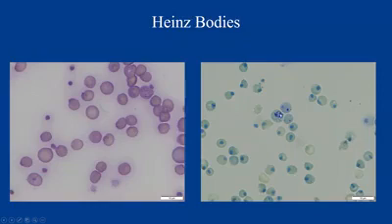It is tricky. This is actually a polychromatophil right here, so a reticulocyte. We used to use new methylene blue manual preps to do retic counts. So these are not Heinz bodies, but all of these nice blue inclusions that are quite big in this case are Heinz bodies, and we were able to confirm the presence of Heinz bodies in that patient. So just a little pro tip.